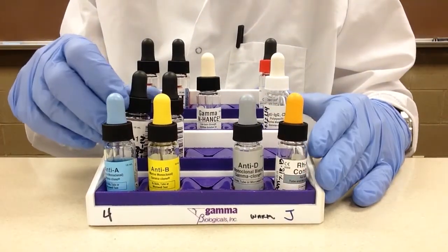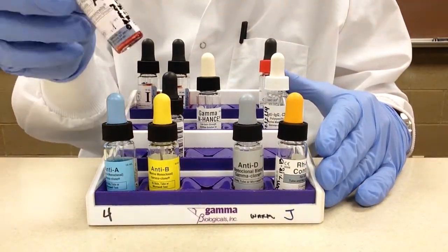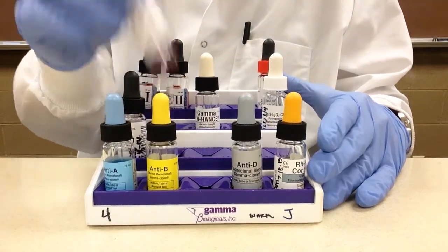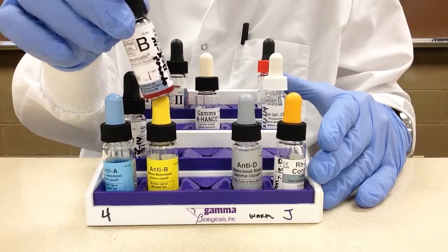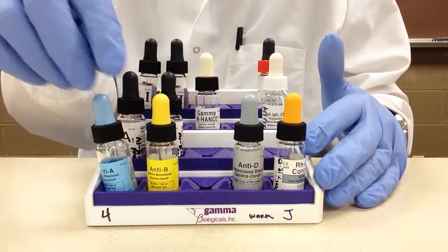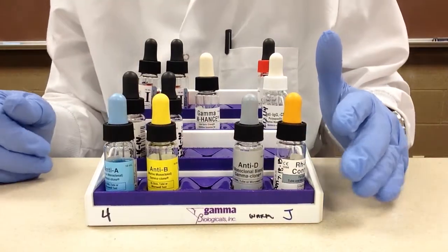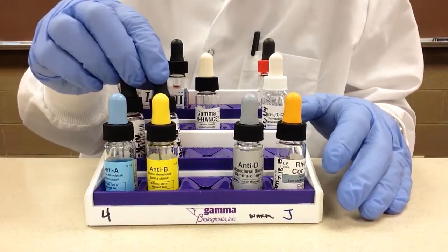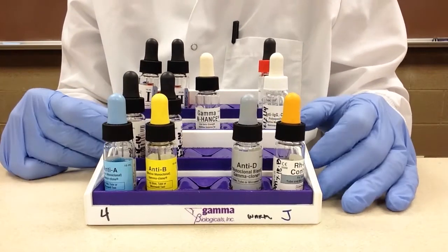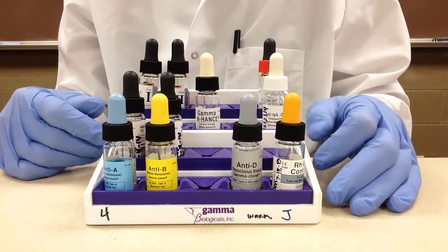Behind that, for our reverse typing, we have our A1 cells and B cells. There are other anti-sera in the front — there's anti-AB and of course there are A2 cells and O cells — but in this laboratory we just keep it with AB.